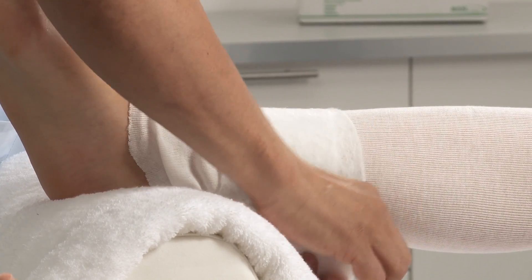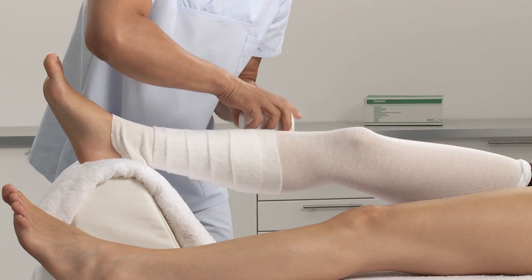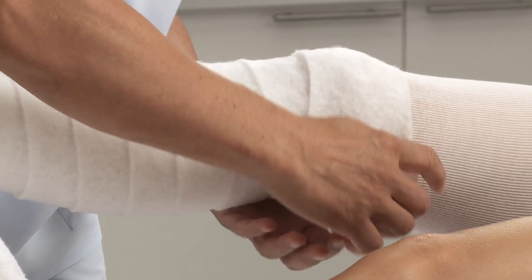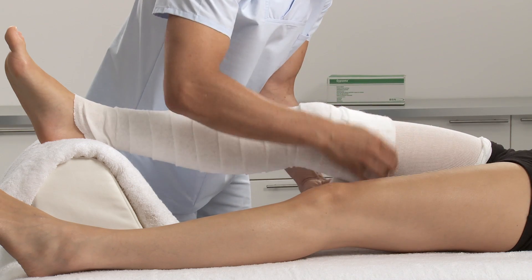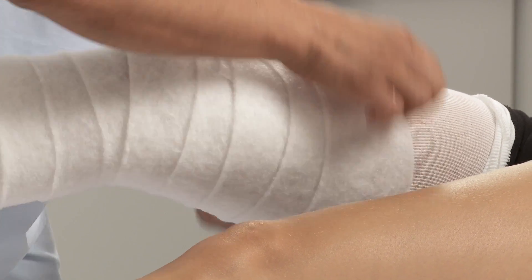Apply padding to the limb by wrapping it from the ankle up to the thigh. Use a second roll of padding if needed. Use extra padding for any bony prominences.